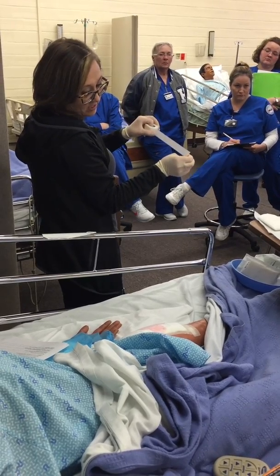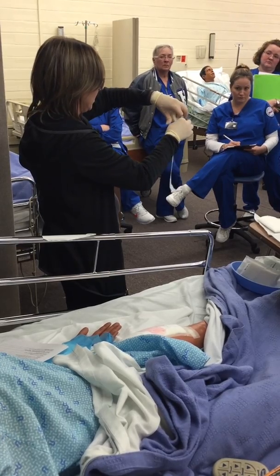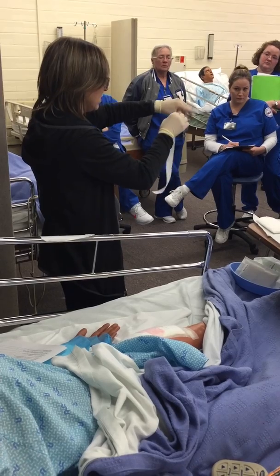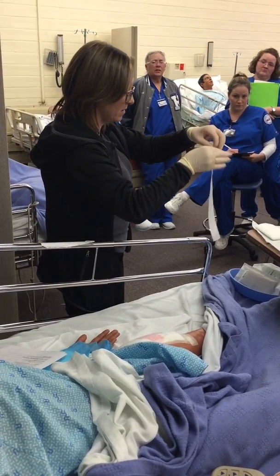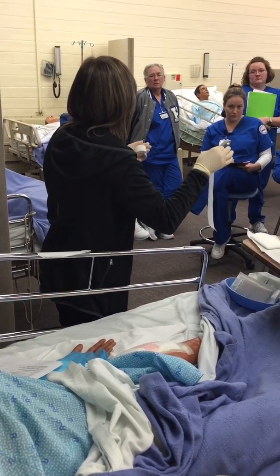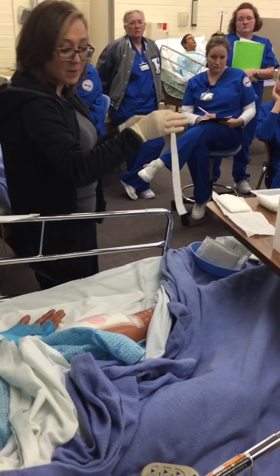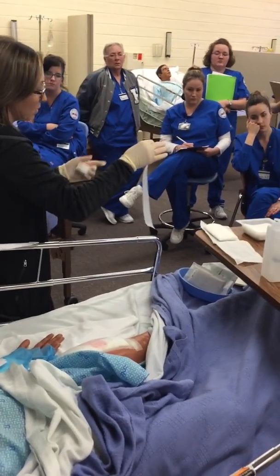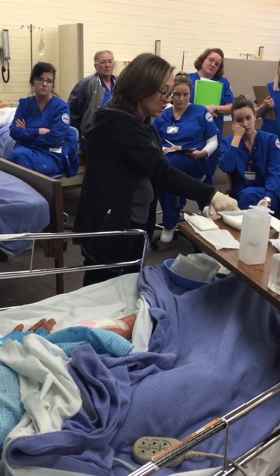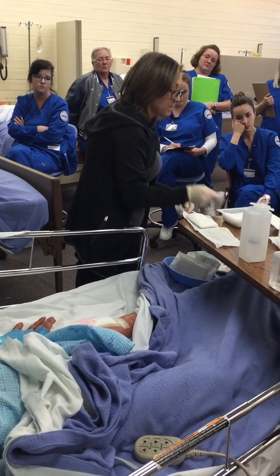So I'm just looking at the dressing. You can always overdo it and then you can tear pieces off. So I'm just going to do that. Would you tear the tape before you put your clean gloves on, or does it matter? You can, or you can do it after. It doesn't matter really, because it's going to be on the outer portion of the dressing. So I've washed my hands, so my hands are clean, and then I'm going to put my tape on here. Make sure you clean your tables off, and you wouldn't want that hanging like that either. Let me redo that.